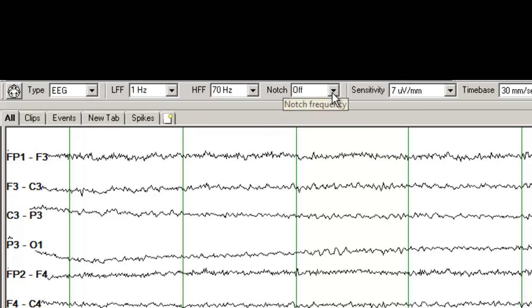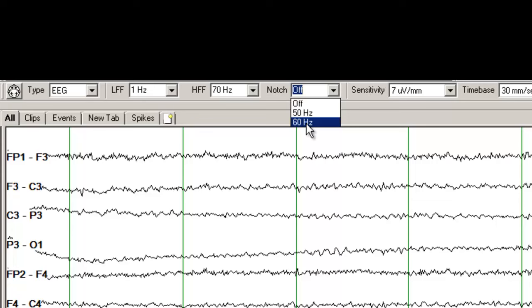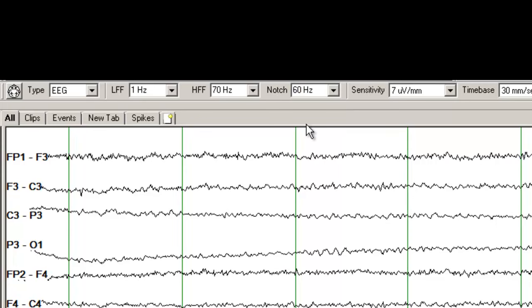This is a notch filter. The notch filter basically gets rid of electrical artifacts. So if you have an artifact coming from the electrical outlet, depending on what part of the world you live in — if you are in North America, you will be using a 60 Hz notch filter to get rid of some of those artifacts.